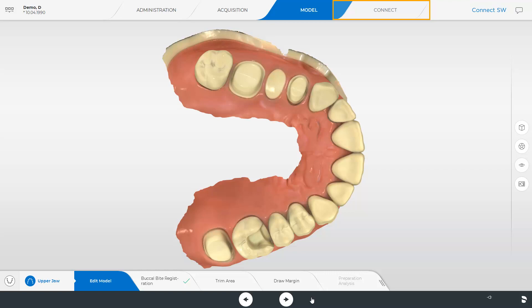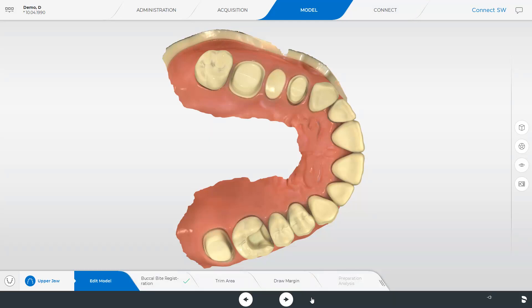Now we could already send the case through the Connect Case Center portal to our partnering lab. Alternatively, we can proceed with the steps in the step menu. It is recommended to draw the margin. Drawn margins are only transmitted after importing the scan data in the in-lab software or Exocad software. Exported STL data will not deliver drawn margins.